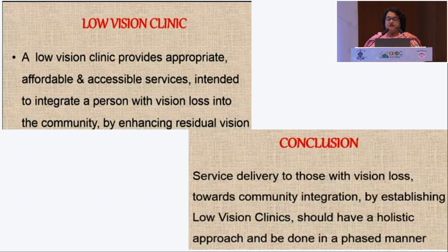So a low vision clinic need not be very high-tech. We can devise new methods like the use of the mobile phone they are already having. We need to give much chair time to the patient and the parents for counseling and letting them know their rights and all the avenues available.